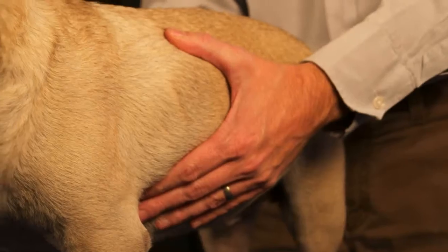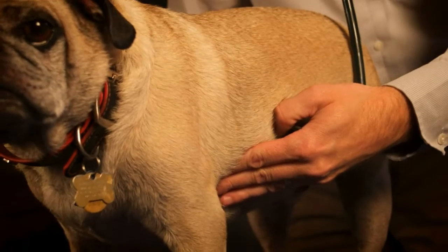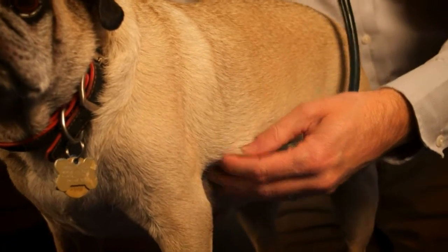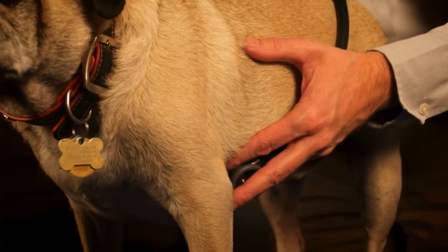Generally, we'll begin our cardiac auscultation at the area of the apical beat. That's generally at the location of the mitral valve. We'll want to listen with both the diaphragm as well as the bell of our stethoscope. So we'll begin with palpation of the precordial impulse. We'll begin our auscultation at that level while simultaneously palpating the femoral pulse quality.